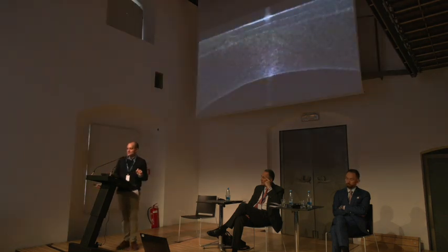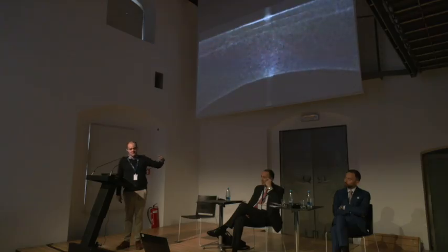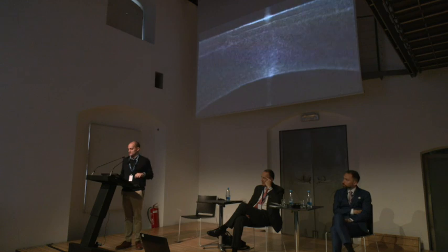Oh, here it is. Without using applanation view, we could never see it because it was so tiny. But the applanation-like view allowed us to image it. I took the image printed from MS-39, I just circled it, I went in with a smile hook, took it out, it was less than 40 seconds of work for me because I had the tool to show it.